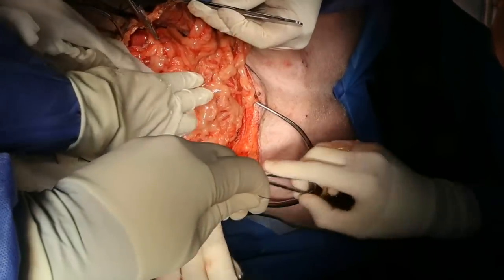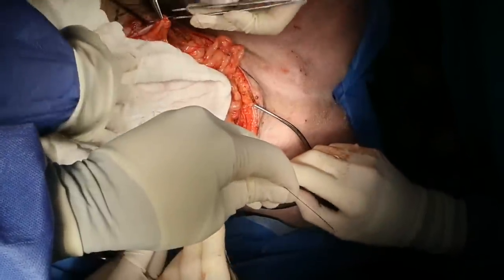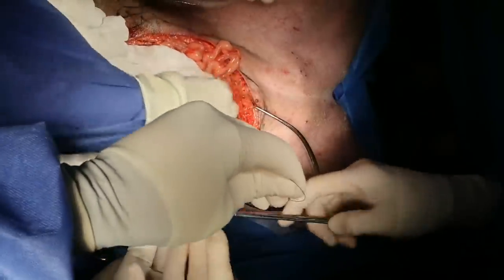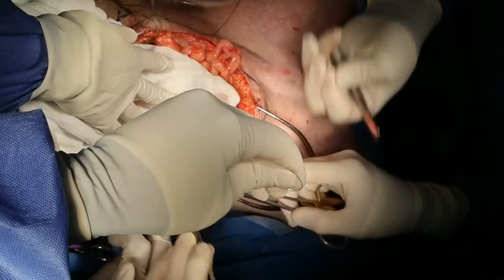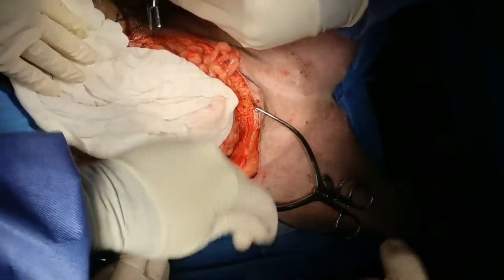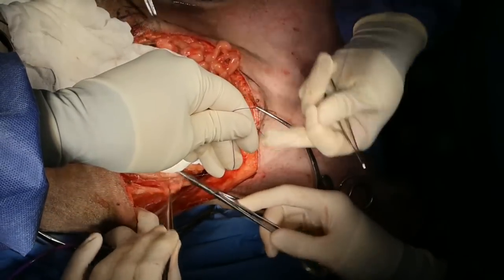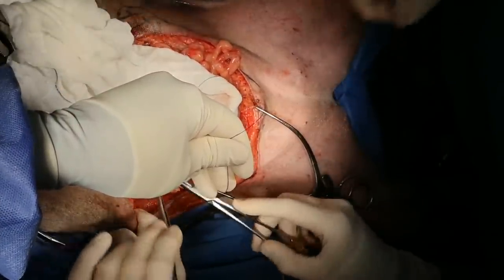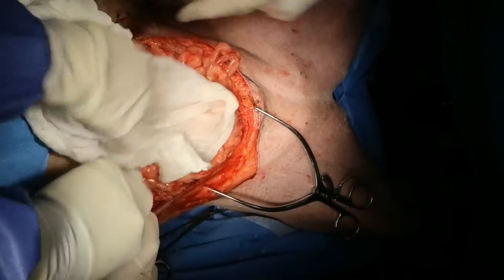The omentum is also going to help with healing, bringing blood supply in. The other nice thing is if, heaven forbid, we have to remove that mesh, that omentum is going to create a really nice fibrous layer. If you waited a month, you could take the mesh out and still have protection of the abdominal contents from herniating out. Switch sides.